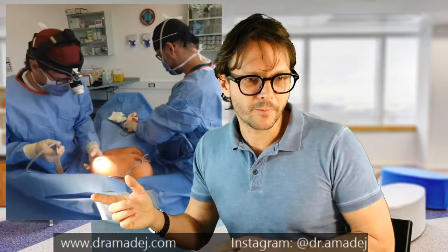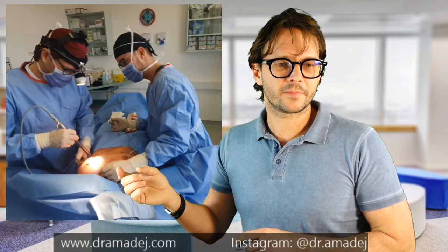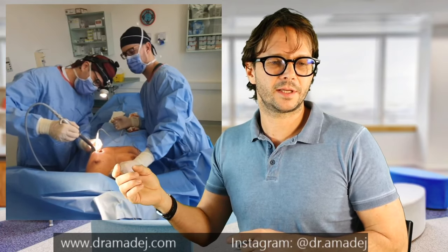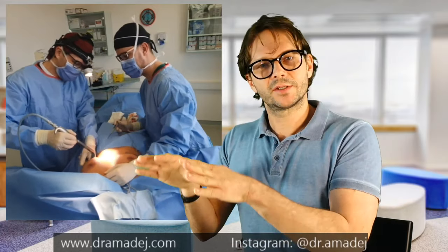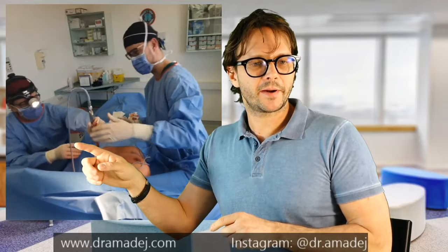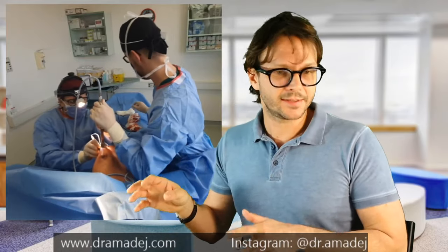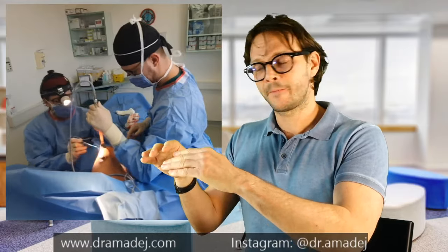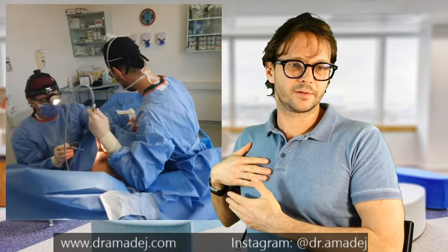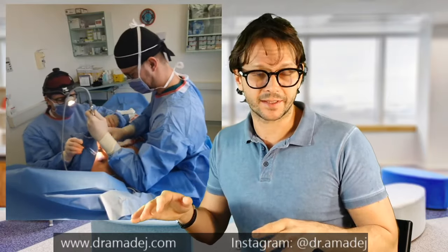I'm now using my finger to make the pocket bigger and checking everything is in the right shape and form so the implant will fit perfectly. The pocket we prepare is under the muscle. As I explained, it's actually dual plane — which means part of the implant is below the muscle and the lower part is under the skin or the gland. It's called sub-muscular, subpectoral, or dual plane — more or less the same thing.